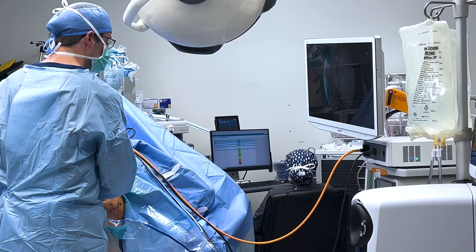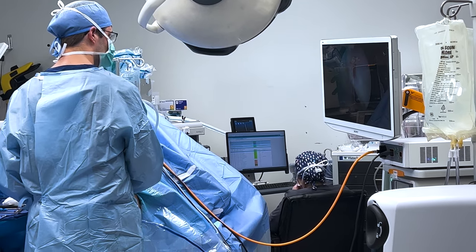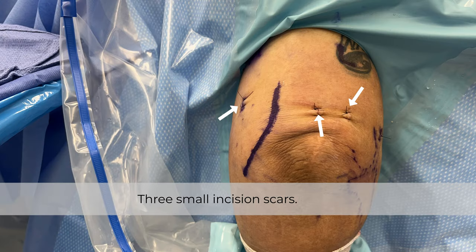After the tendon is removed, we will check the anatomy of the joint to make sure that everything looks good and close the incisions.